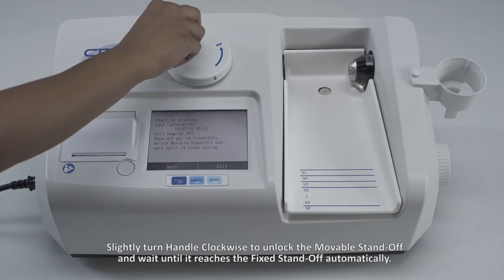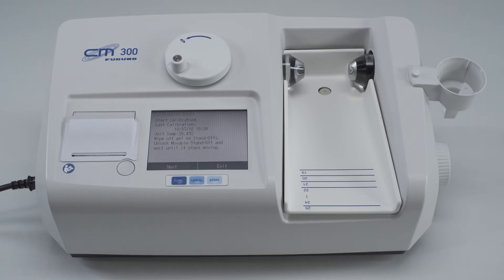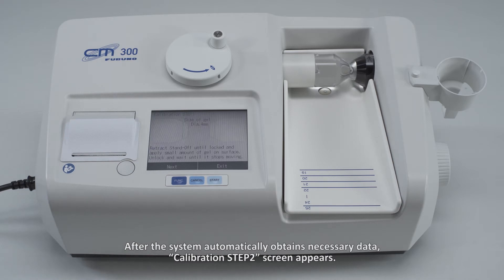Wipe off any contamination on the standoffs completely prior to calibration. Slightly turn the handle clockwise to unlock the movable standoff and wait until it reaches the fixed standoff automatically. Wait about 10 seconds to stabilize the contact between the standoffs and tap Next. After the system automatically obtains necessary data, calibration step 2 screen appears.